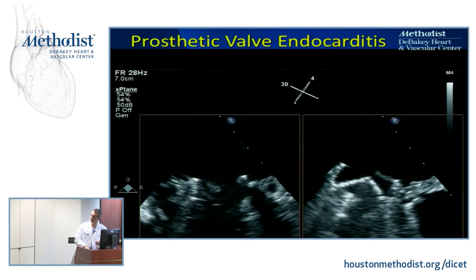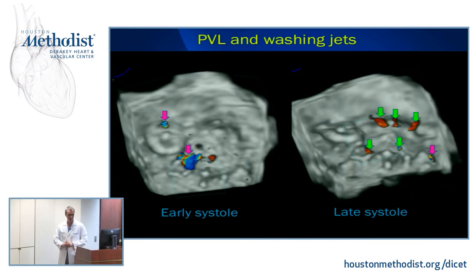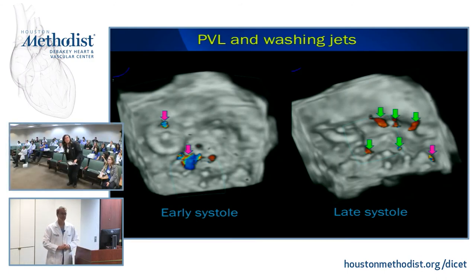Steve, it seems like most of these paravalvular defects are crescent-shaped. Yeah. But most of the occluders you use are round. Yes. Has anybody started to say, let's... So in Europe, they have a couple that are oval-shaped. It's not easy to put a full crescent in because it's hard to orient that. But in Europe, they have some. None of the devices we use, not a single one, is actually FDA approved for this. They're PDA occluders or vascular plugs. Every single one is off-label. But in Europe, they have their equivalent of on-label devices.